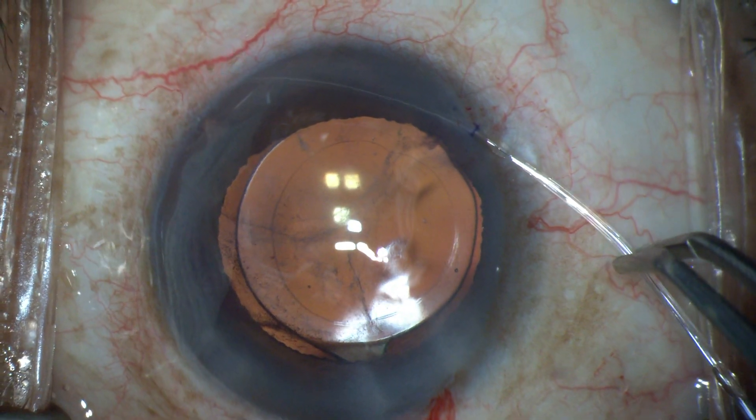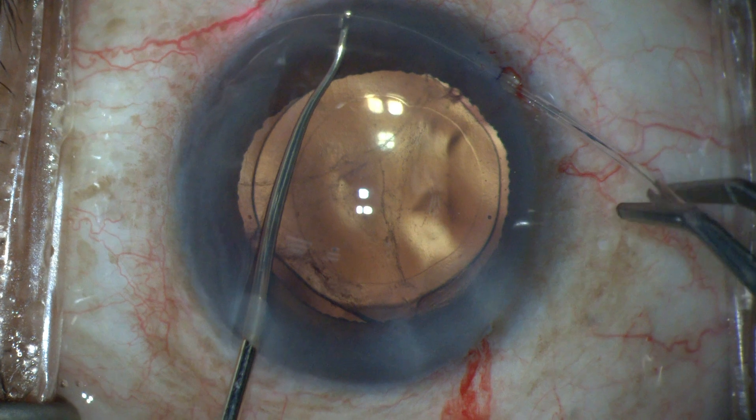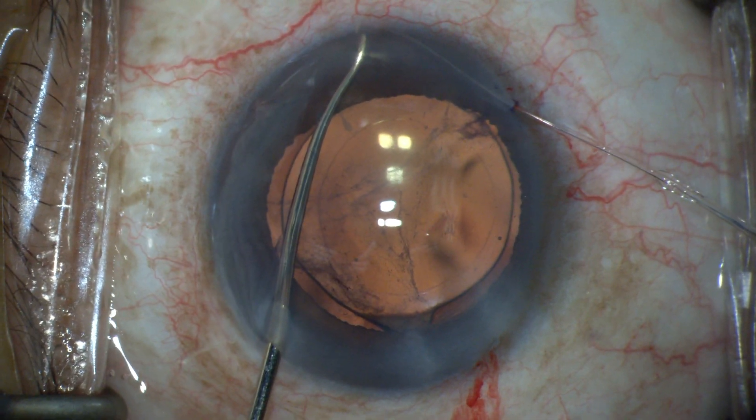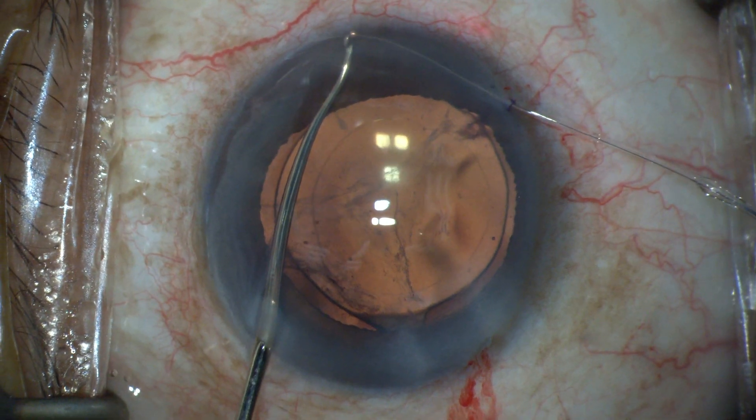When tension is placed on the microcatheter outside the eye, tearing of the goniotomy is noted. A Kuglin hook is therefore placed in the eye and used as a fulcrum to support the microcatheter during withdrawal and viscodilation.